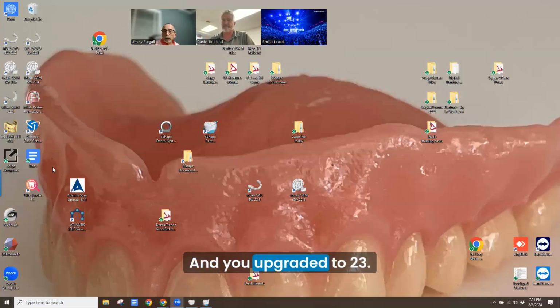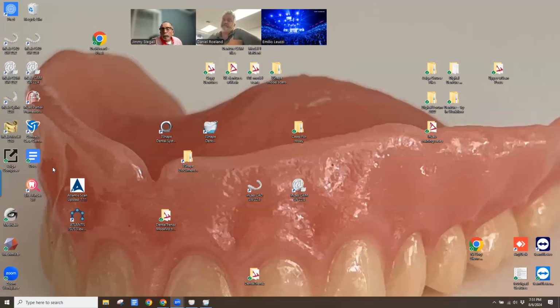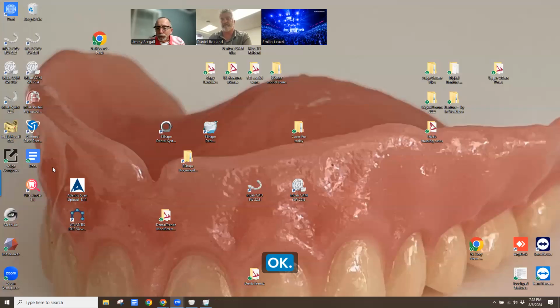And you upgraded to 23, so you have the try-in workflow now. That's cool. We'll go through that next webinar session. I like 23. It's not without its bugs. Never had a version of 3Shape that didn't get buggy at times or didn't slow down.